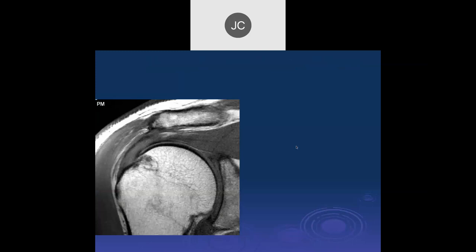Robert: we have another coronal looking at the supraspinatus. It looks pretty thick and increased in signal. I don't see a discrete tear. So there we see tendinosis, and we can also see a traction erosion on the bone — a repetitive traction area. That tendon looks pretty normal to me other than a slight increase in signal.